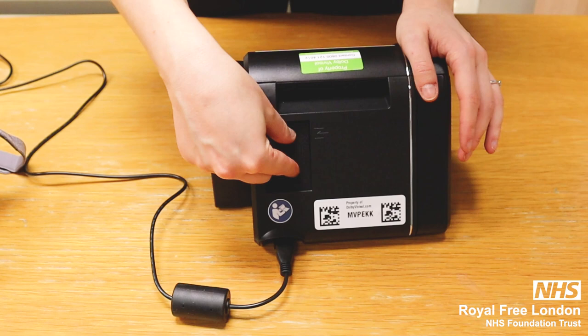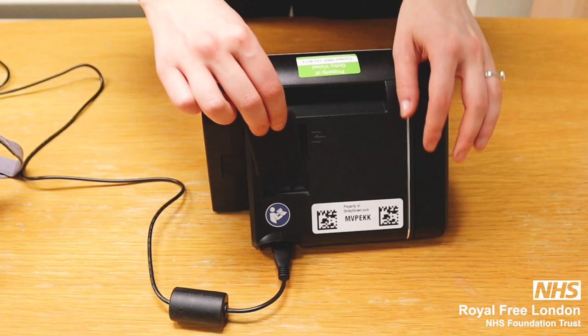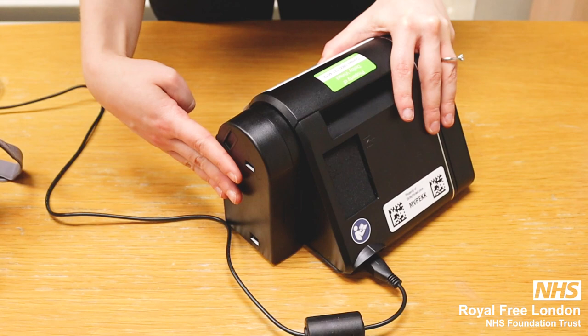You also have a black filter which needs to be replaced every six months. Wash it with warm soapy water, rinse well, leave it to dry, and put it back in the slot when it's fully dry.